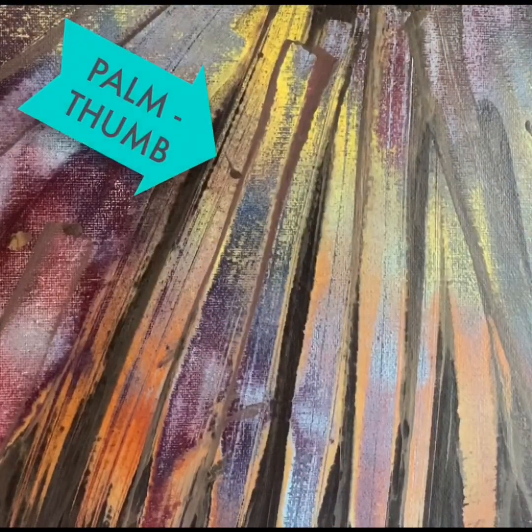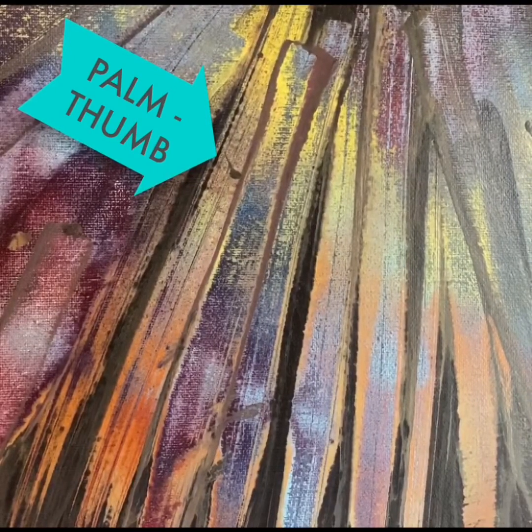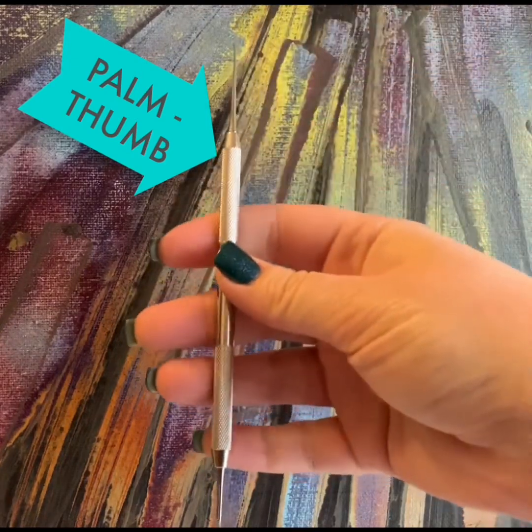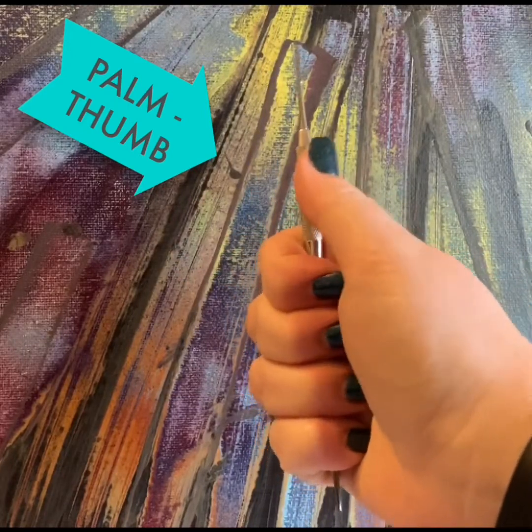Next we have the palm thumb grasp. The operator will grasp the handle of the instrument in the palm of the hand with four fingers wrapped around the handle while the thumb is extended upward from the palm. The palm thumb grasp is used when the instrument has straight shanks and blades, such as a straight chisel or a Wedelstaedt chisel, which you'll see here. Here's a Wedelstaedt chisel, and I'm going to grasp it with a palm thumb.